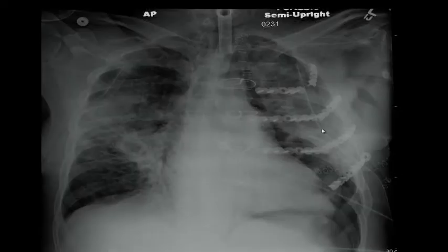Let's go back. Etched means you can see that here. If I give Sylvia a fine tip marker and I say, well, mark the diaphragm not even a point micrometer away, you can't do that because it gets blurry here, it gets blurry here, not here. You can take a pencil and etch it out. You can take a pencil and etch out the mediastinum all along, right?